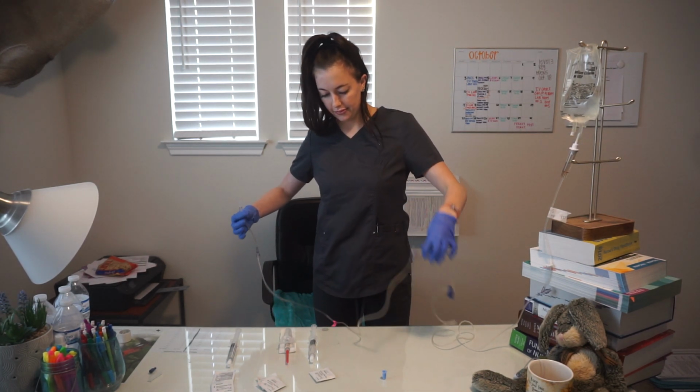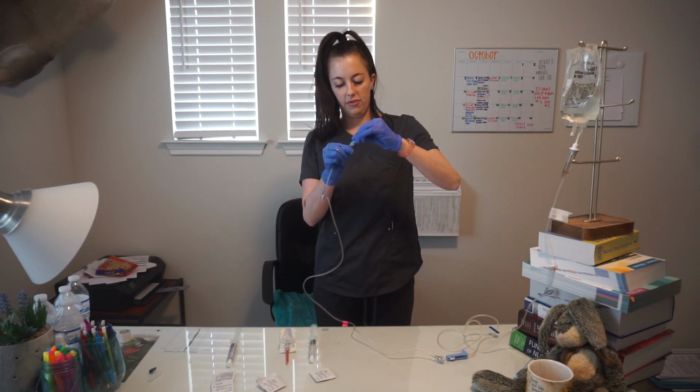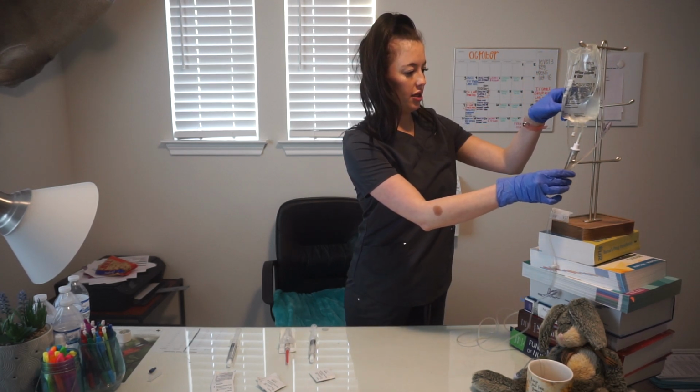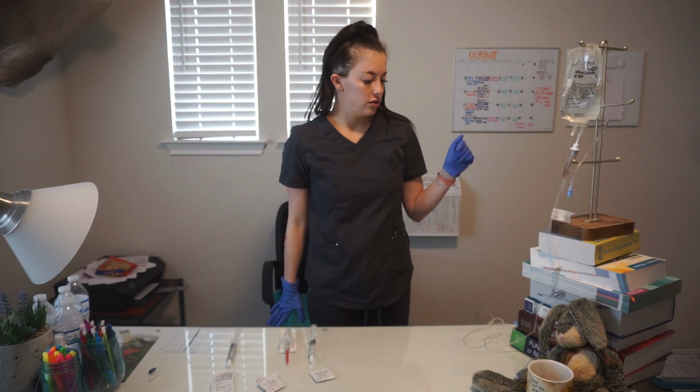Bubbles gone. And I'm going to aseptically recap that. Just hang that for a second. Okay, alrighty.